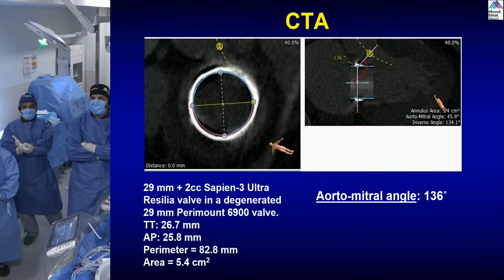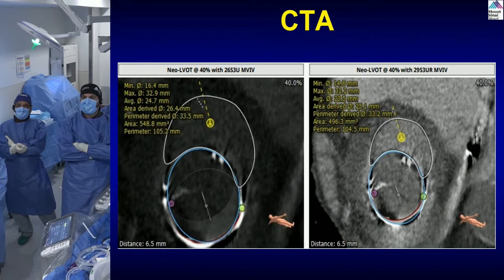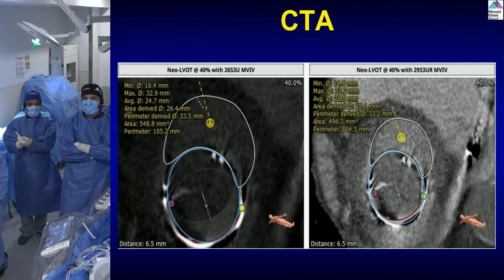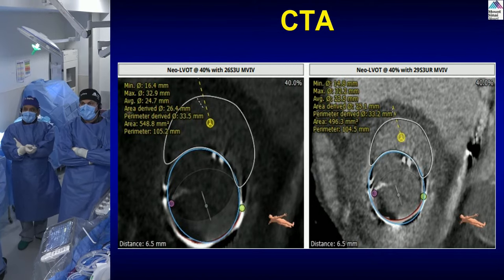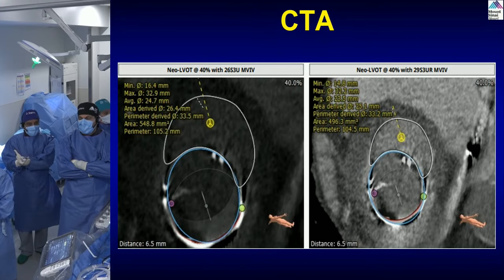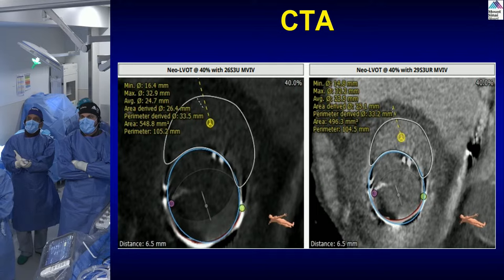If you see the next slide, you'll see the neo-LVOT, which is huge. You need a number above 180, and this is already around 500 plus millimeter square. So you have a big LVOT already. You have a big LV cavity. I don't see any reason for LVOT obstruction here, Dr. Sharma. That's a very important point. The cutoff is about 180. And we have seen sometimes, even with a little septal bulge, it's about 130, 140. We do a septal ablation and then it comes back and becomes 190, 200.